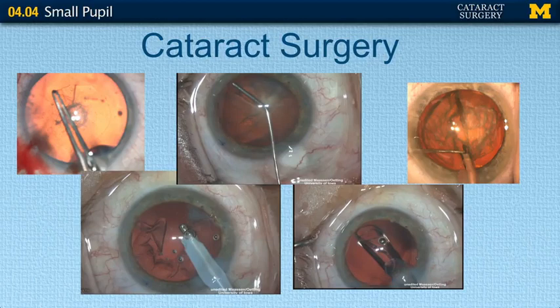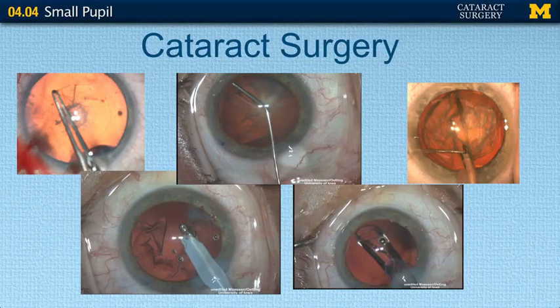During I&A, if the pupil is too small it makes removing the subcortical material very difficult. And lastly, a small pupil also affects inserting the intraocular lens.